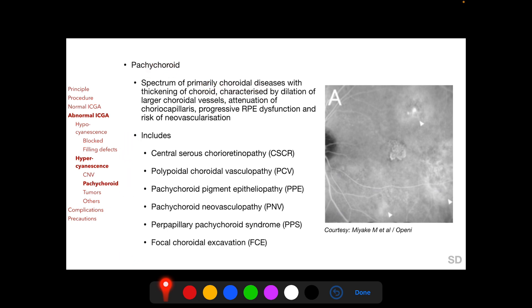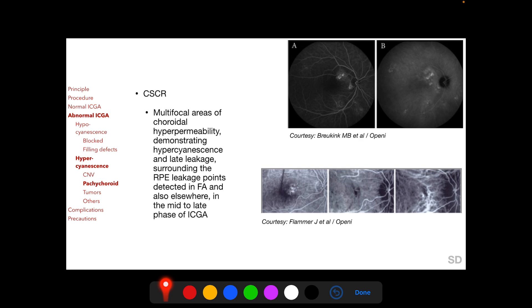Pachychoroid spectrum diseases are primarily choroidal diseases with thickening of the choroid demonstrable on enhanced depth imaging OCT, to be discussed in a separate session. This spectrum is characterized by dilatation of larger choroidal vessels and attenuation of choriocapillaries with risk of neovascularization, and includes entities such as central serous chorioretinopathy and polypoidal choroidal vasculopathy. In the ICG angiogram of a patient with pachychoroid, we find multifocal areas of choroidal hyperpermeability along with a hotspot. Comparing fluorescein and ICG angiograms in central serous chorioretinopathy, more areas of leakage are found on ICG, and in the late phase, dilatation of choroidal veins is also seen.